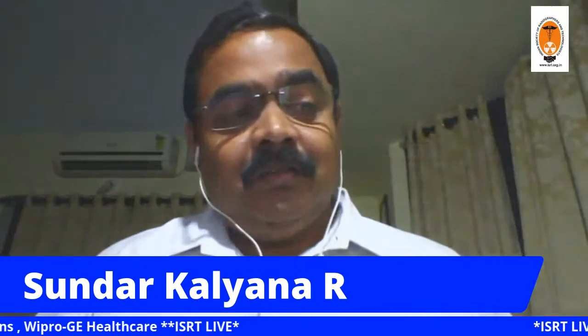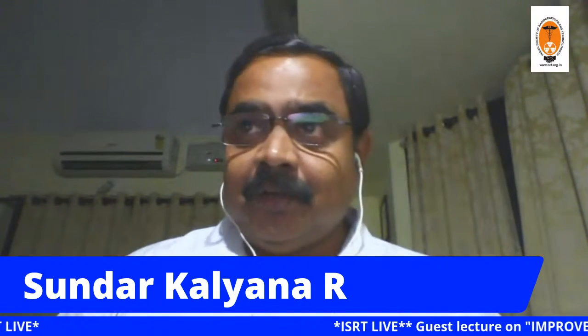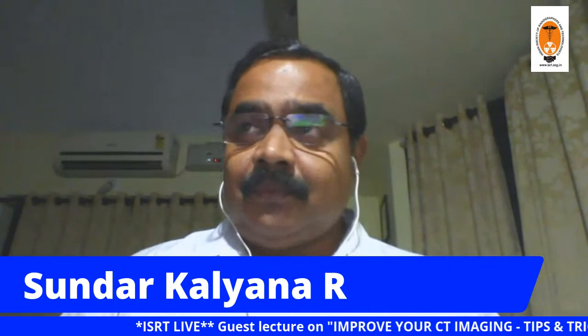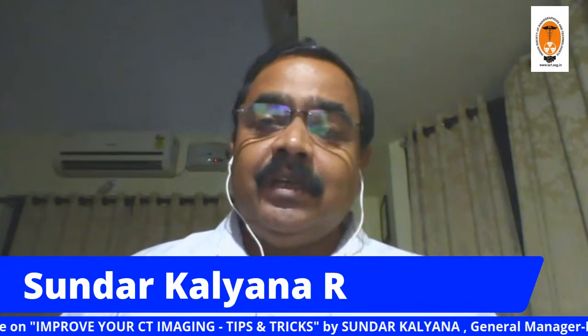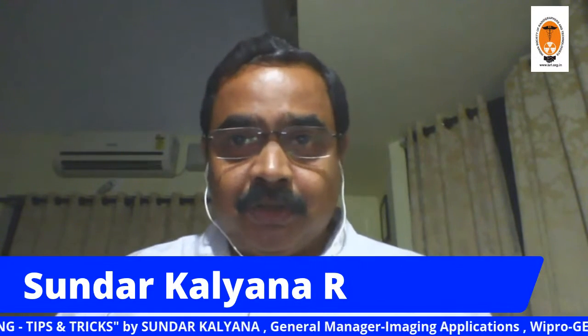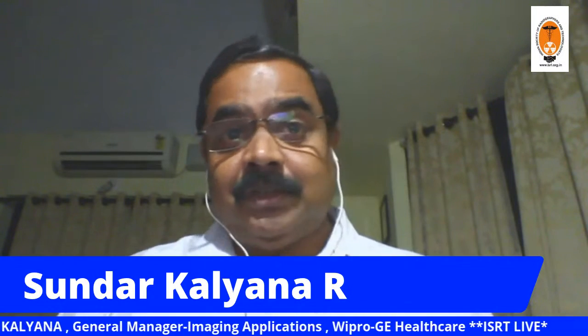Okay. I understand this question. I'll repeat the question for the benefit of all. So the question from Joy is comparing conventional radiography with CT, where in conventional radiography we say that when you use lower kV the dose to the patient is high, and that's why we use high kV for chest X-ray.